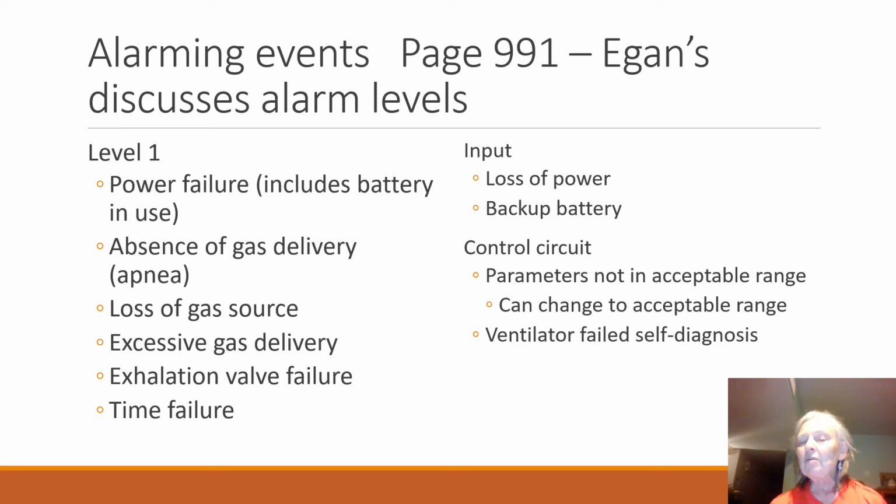The vents, for the most part, though, are very good about not letting you do something you're not supposed to be able to do. However, if the vent is not working appropriately, that alarm may still not alarm or cause some problems for it. A ventilator that's failed self-diagnosis is not going to let you use it. It used to be at one time you could work your way around it, still use it, and then call biomed and ask them to come repair it. Normally they would tell you as soon as you take it off the patient, let us know, we'll be down there. Nowadays, if you do not pass your test, your SST, EST, depending on the vent, it will not let you use it on a patient.